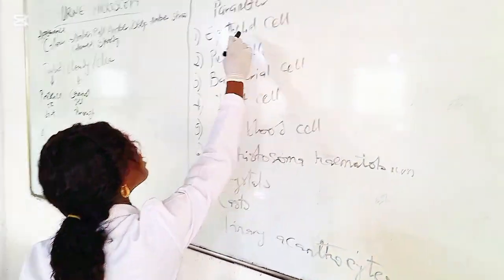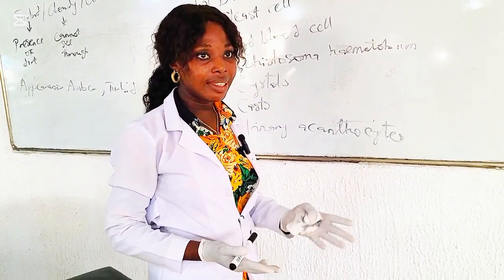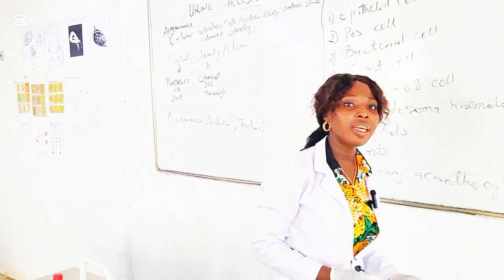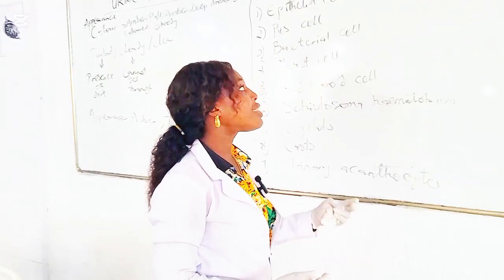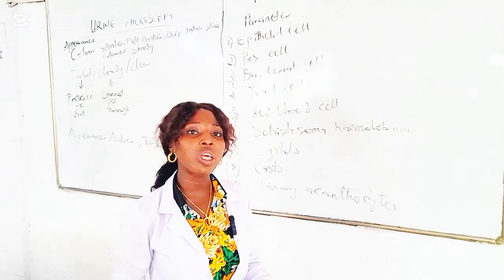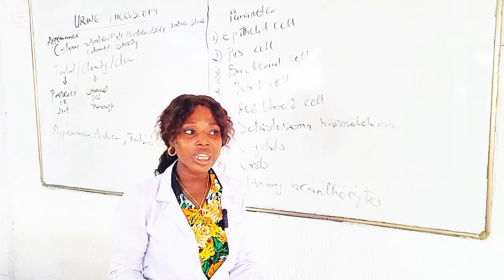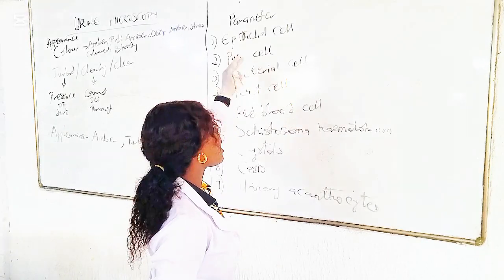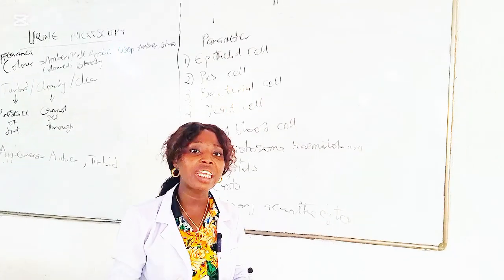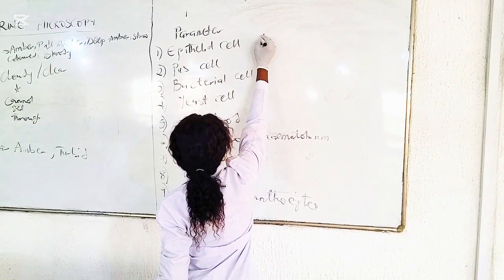So, first of all, what are epithelial cells? There are some cells that line some organs, like your squamous cells. There are a lot of them. These cells exfoliate on their own, what they call spontaneous exfoliation. Even a normal person should have epithelial cells in his urine sample. It's not a problem. It becomes indicative of urinary infection if it is more than 1 plus.